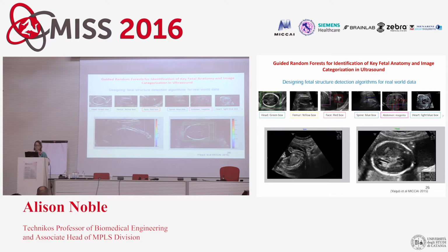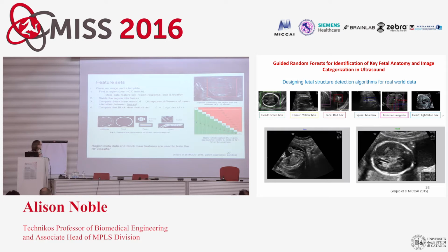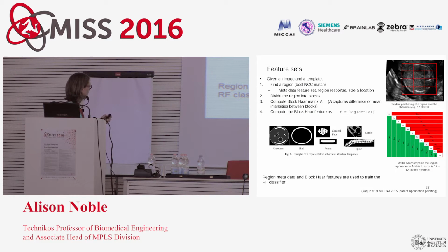And when you look at heads as well, it again likes to think that there are femurs there because it's got the linear structures, but it will home in on the solution. Part of that is when it starts to use those internal structures that are unique to what characterizes a brain.